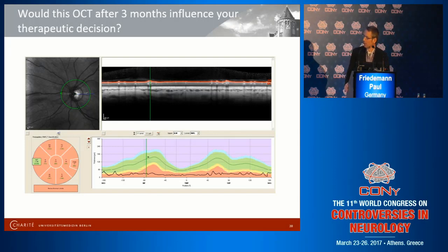From the images Atina showed you, you can now clearly diagnose a significant thinning of the retinal nerve fiber layer across the entire ring scan, here in black. In the red range are the individual values of this young lady compared to the normative database. So this made clear that severe structural damage emerged from this first attack of optic neuritis.